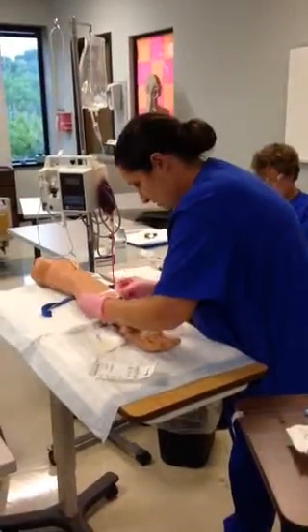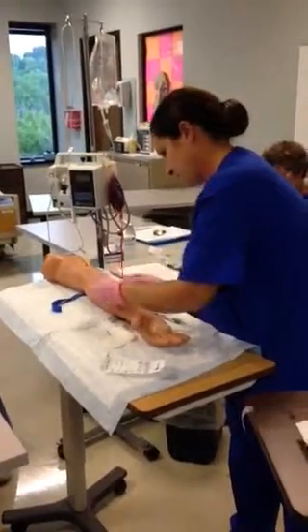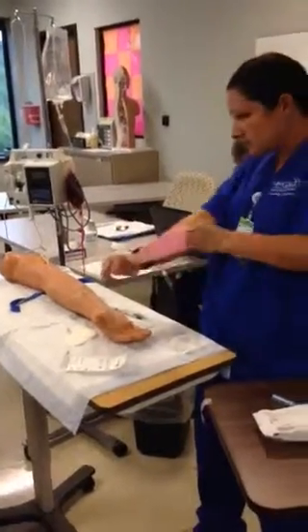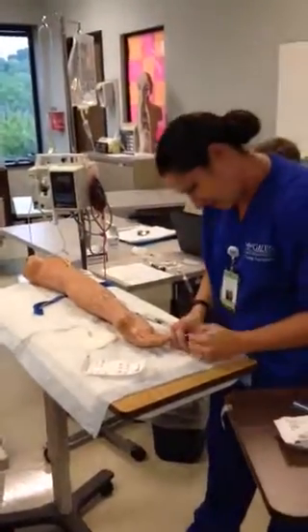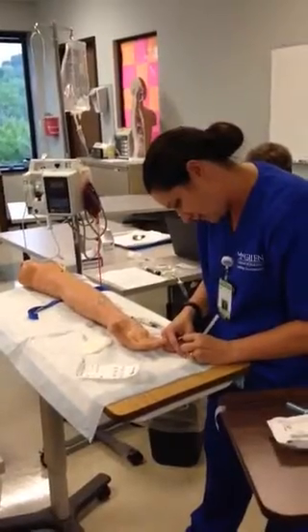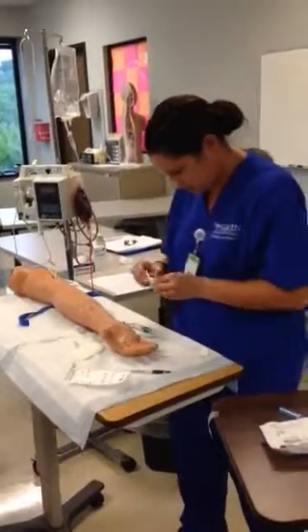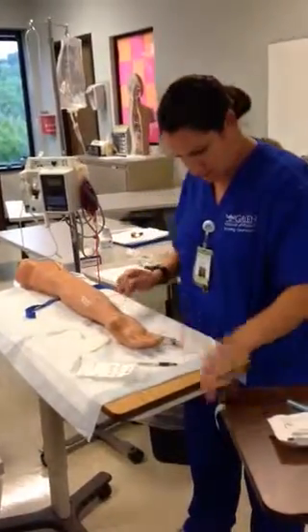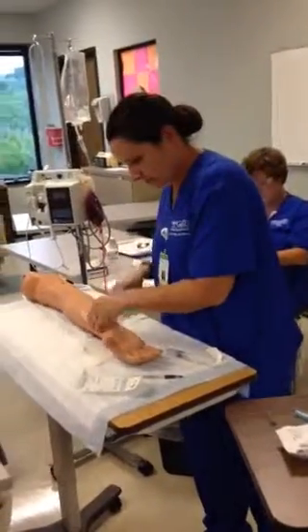Put this on there. Alrighty. I'm gonna put some sharps.